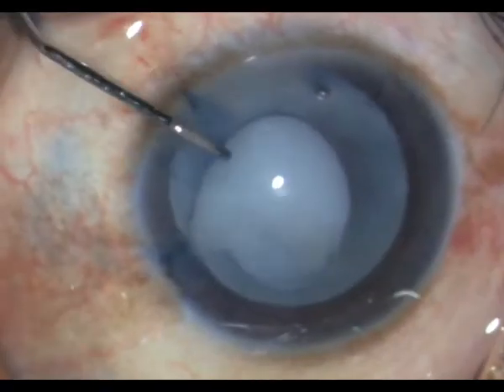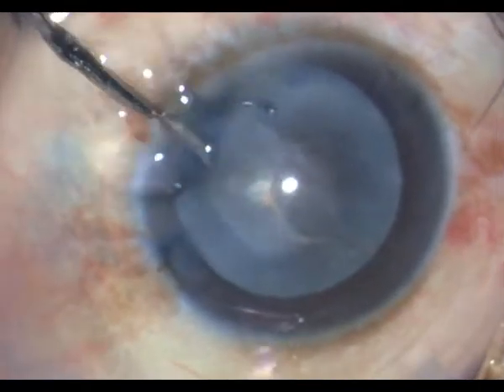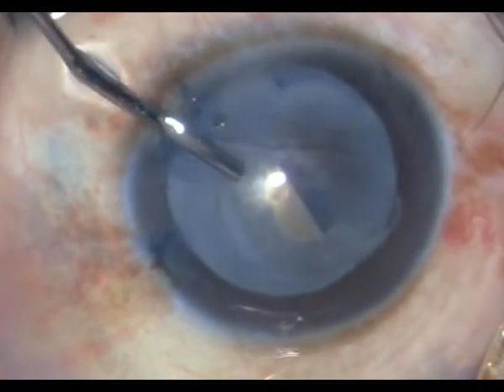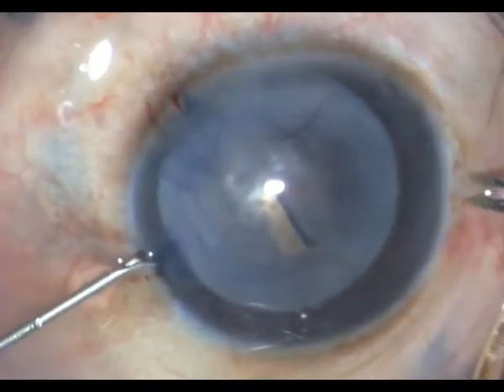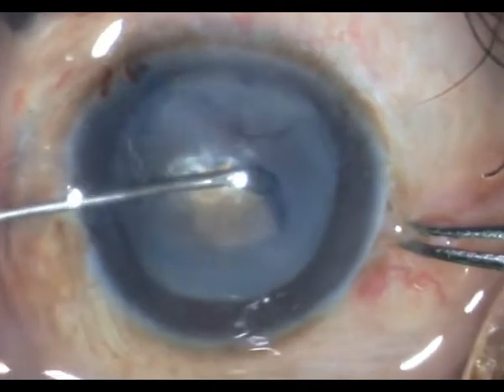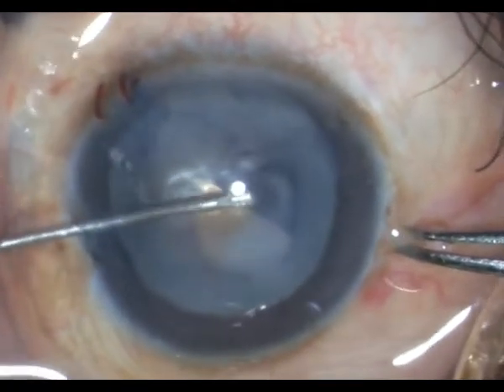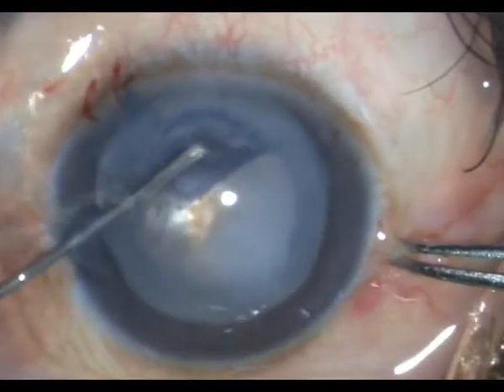As expected, there is a gush of liquid cortex. I just wash out a bit and then place HPMC within the anterior chamber, taking care to flatten the anterior capsule. Then carefully engaging the underside of the capsule, I go ahead to complete the rhexis.